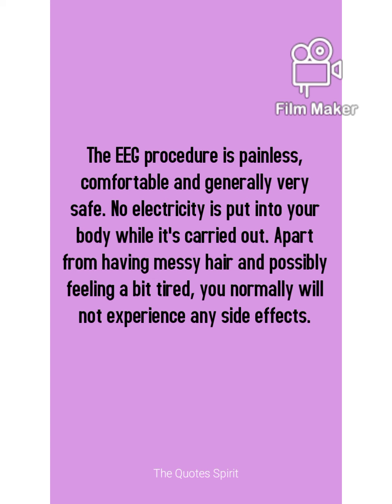Apart from having messy hair, because the electrodes, which have small metal discs, are placed on your scalp, and feeling a little light-headed or having a slight headache because of the flashing light at the end of the test, nothing is going to happen to the patient who is undergoing the EEG test. It's very safe.